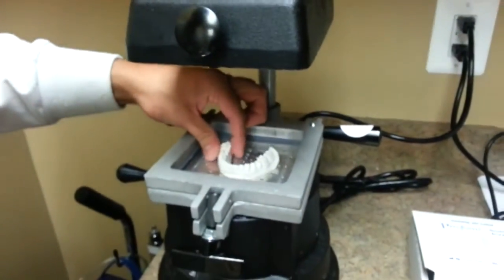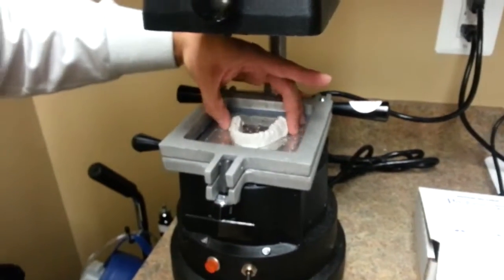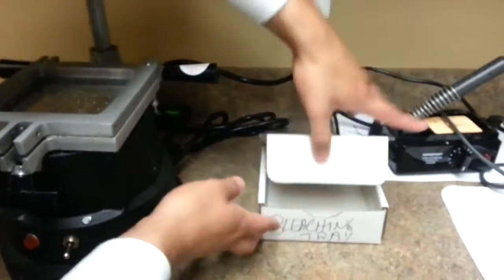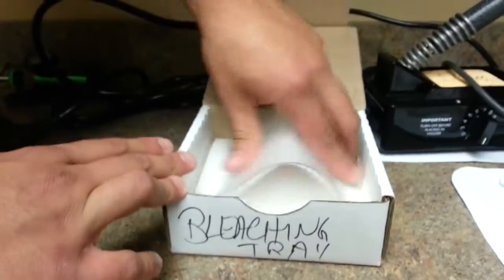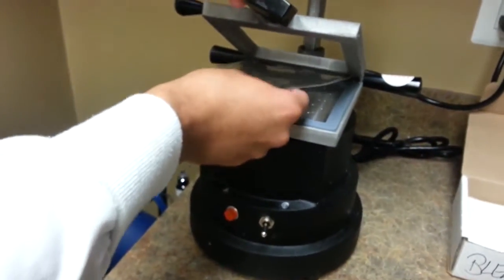Now we're gonna put the model at the bottom. Actually, we're gonna do the tray. Now, these are our bleaching trays, plastic. This is the plastic that we use for the bleaching tray. So we're gonna grab one out of here. They're gonna look like this. We're gonna open this up, put it underneath here.